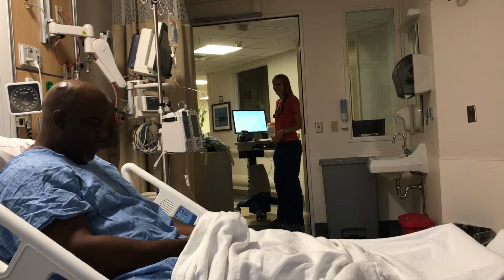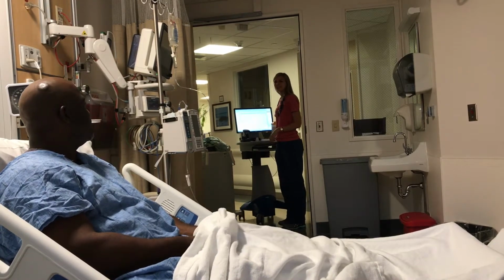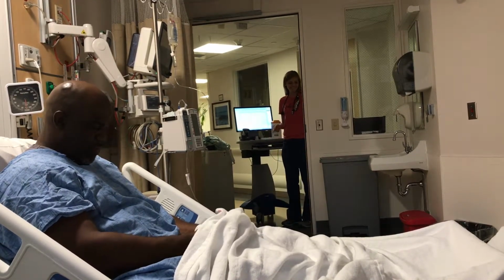Hey, Mr. Holiday. Hey. I've got some meds for you. All right, Margaret.